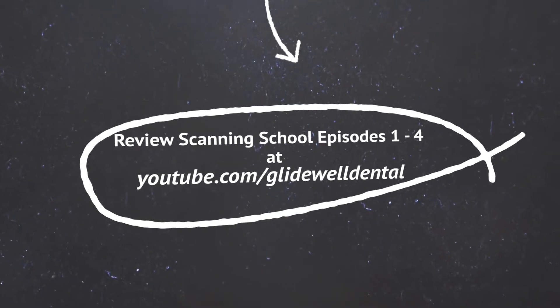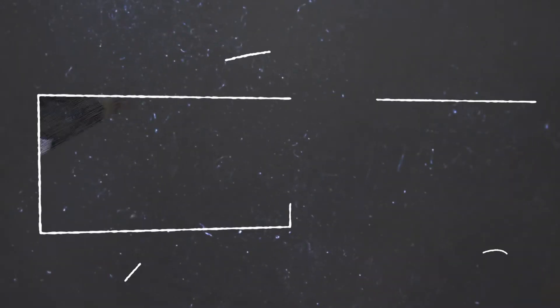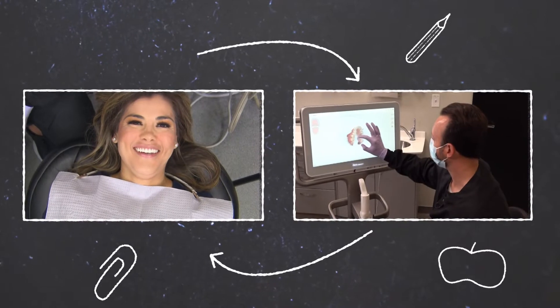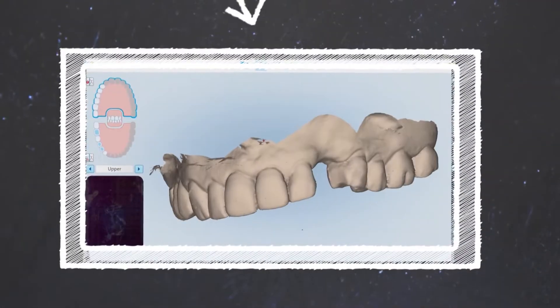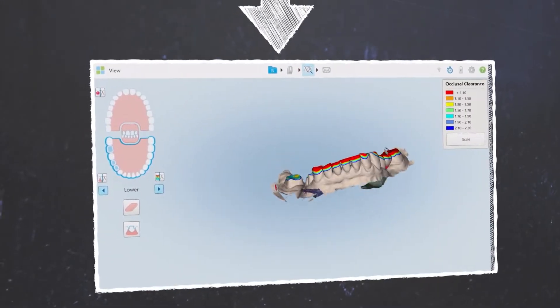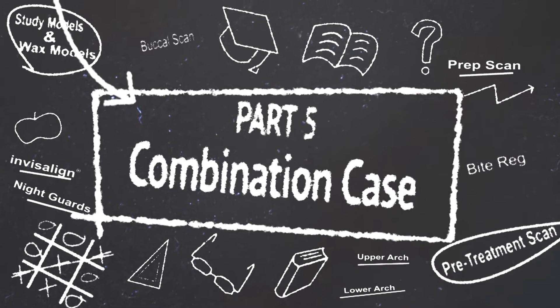As always, if you're just tuning in for the first time, take a moment to glance at some of my previous episodes, especially if you are a beginner with the iTero Element scanner. Let's look at a combination case: a posterior crown for tooth number 28 and a three-unit bridge span from 29 to 31. Time to get started.